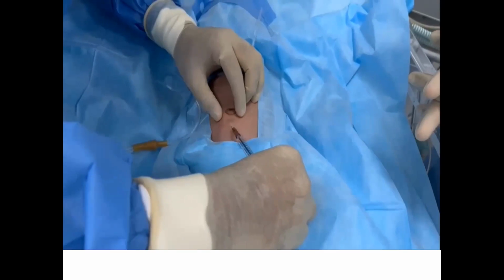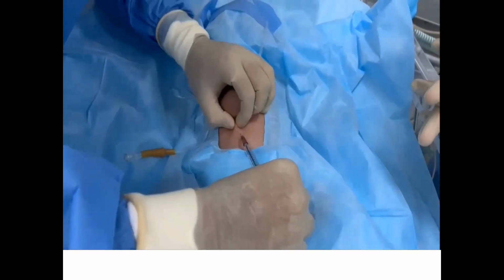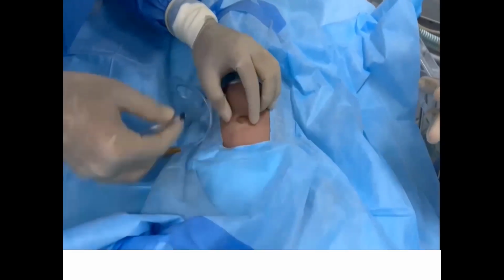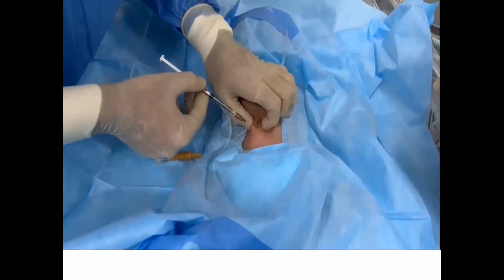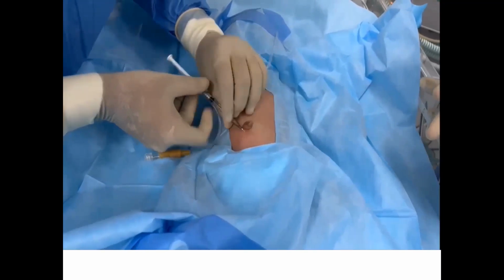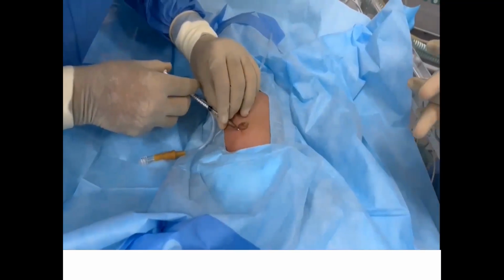The most common site we use for PD catheter insertion is just below the umbilicus in the midline. We can also use the left lower quadrant of the abdomen as well as the right lower quadrant of the abdomen for PD catheter insertion.